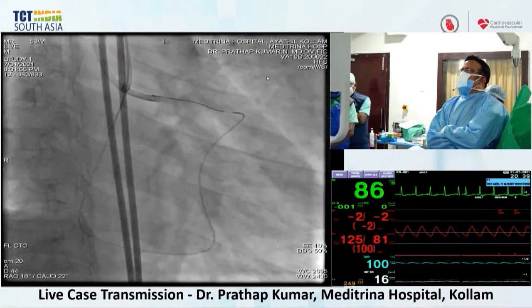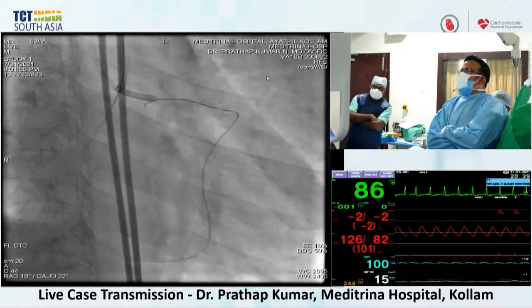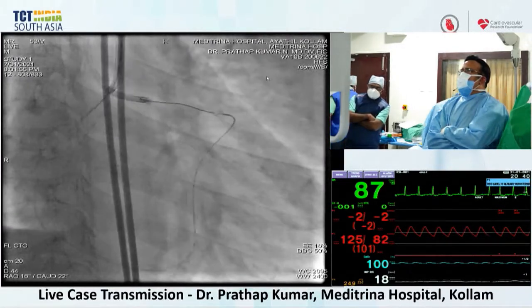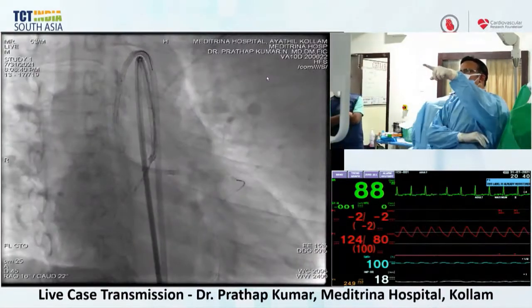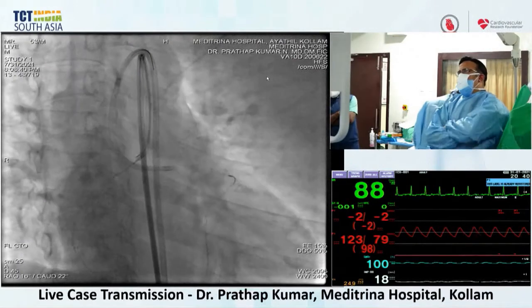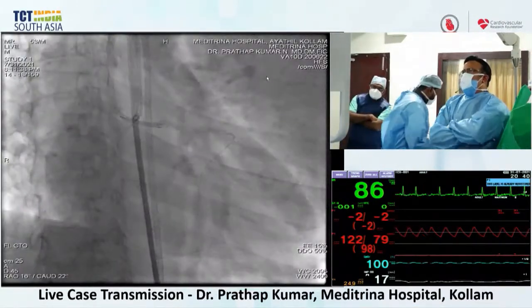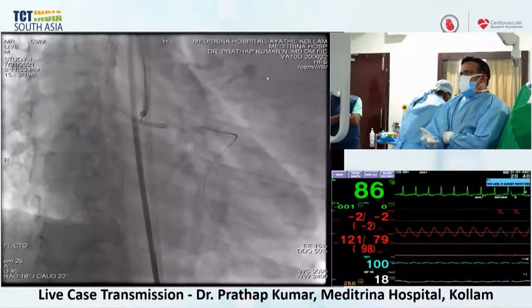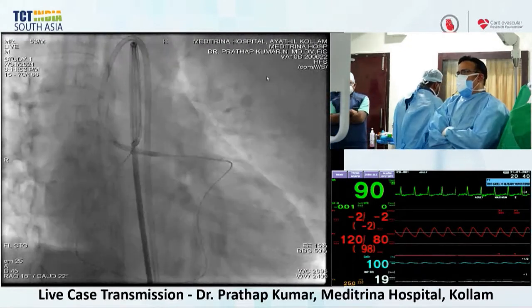We crossed in this one? No. So as you did this, any thoughts about putting a safety wire down the circ and/or using a guide extension catheter towards the ostial LAD? No, this is actually when we crossed, and then we did a balloon dilatation, trapped, and then next, we took the microcatheter inside, naturally as a normal retrograde intervention. Then we put a wire inside, that is actually the RG3 wire.